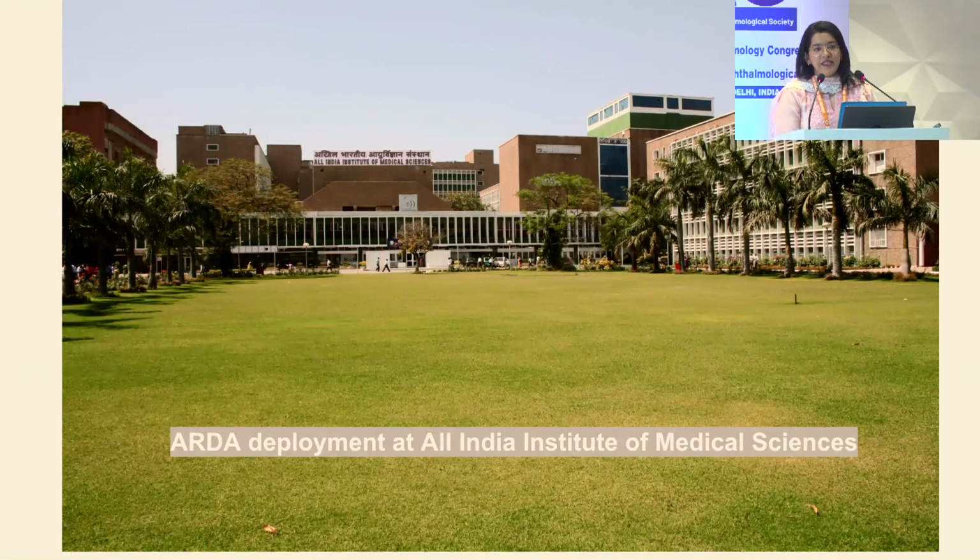So coming to the use case that we have at All India Institute of Medical Sciences. I'm sure all of you are aware that we've deployed ARDA across ophthalmic institutions. Arvind Eye Care has been one, Shankar Netralaya has been another one. But what we actually wanted to do was go to the root cause of the problem. Diabetic retinopathy is best treated by repeated and early screening. We wanted to go to a place where diabetic patients were coming in day in and day out for checkups, reviews, and things like that. We also wanted to work with a younger population. So 18 to 45 was the age group that we were looking at.